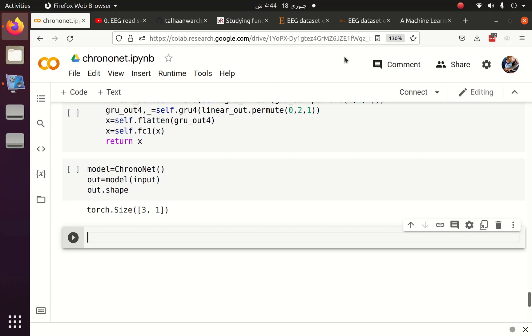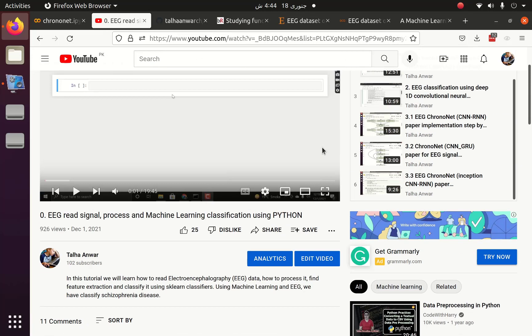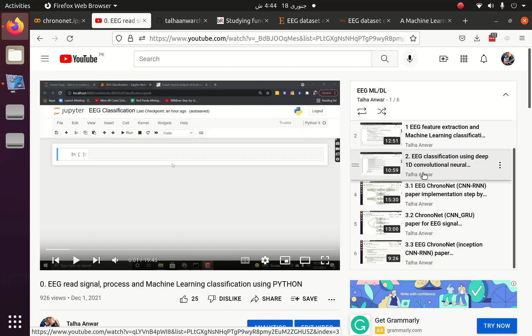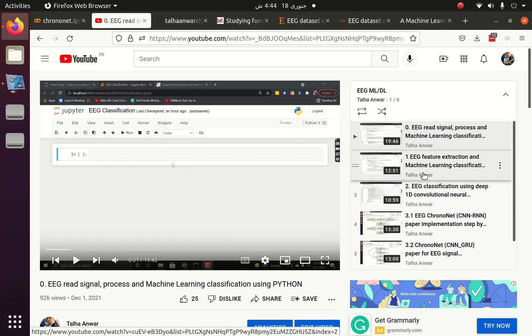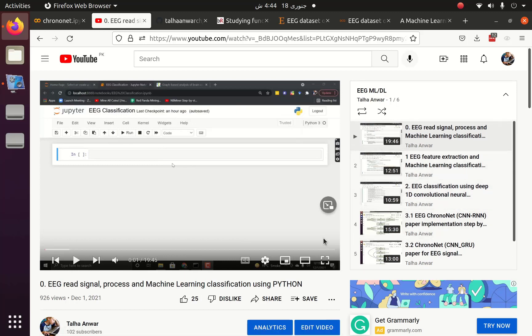Greetings everyone. Welcome to part 3.4 of the ChronoNet series, or the EEG ML series. In part 0, we saw how to load data using MNE when the data was in .edf format. After that, we used machine learning, then CNN. In the ChronoNet series, we saw how to build a CNN-RNN architecture using PyTorch. Now it's time for the data preparation.